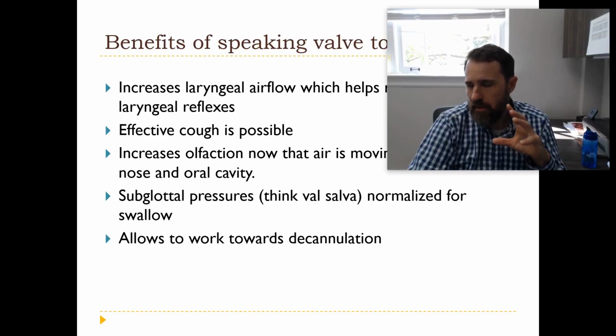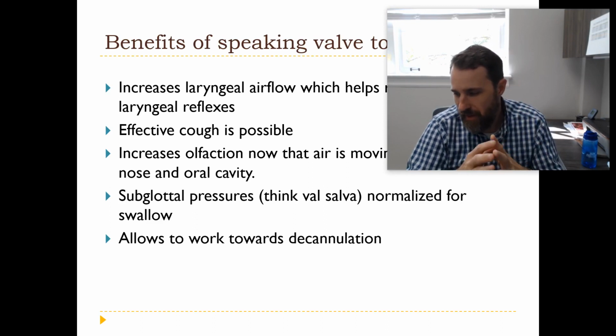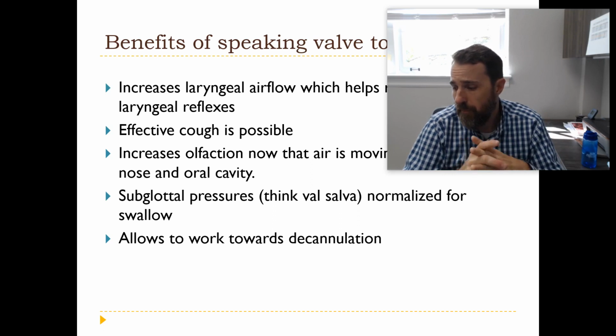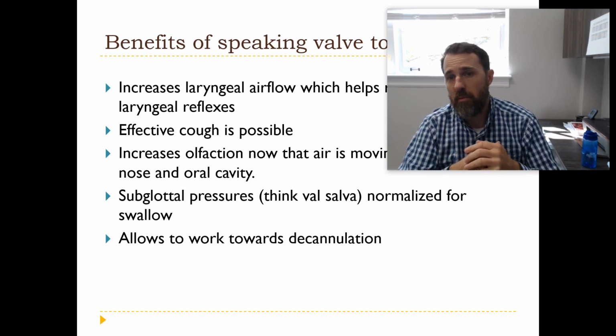So placing the speaking valves in children and babies is super important because otherwise they're not going to develop their normal speech.